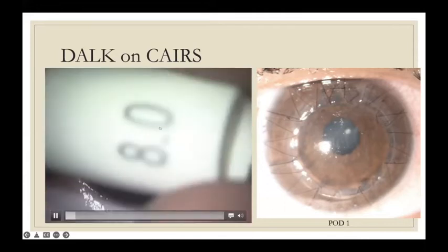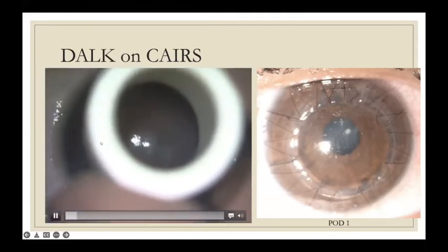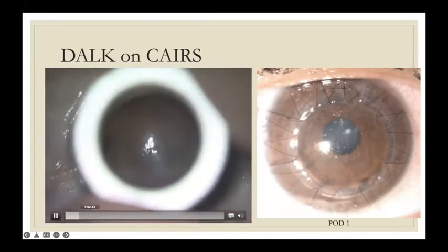This is a patient who progressed post-CAIRS. She came back after 1 year because of the pandemic. She was completely lost to follow-up, a young girl who continued eye rubbing. And I'm showing this video to show you that DALK can also be easily performed after CAIRS.